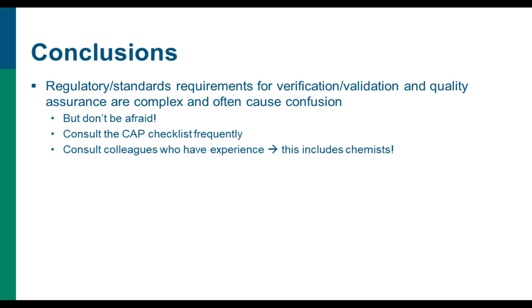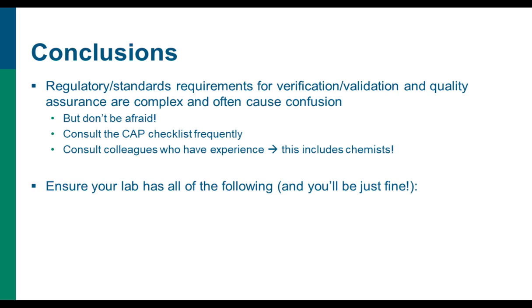But don't be afraid. Consult your CAP checklist frequently. They are very well defined there, and with time, CAP has gotten more specific with their requirements and more defined, so it's easier to understand. And don't be afraid to consult colleagues who have experience and ask them if you have questions. I put an important point here that this includes chemists. We don't often think of consulting with chemists in the microbiology lab, but they validate and verify quantitative tests all the time. Essentially, most of their tests are quantitative, so they are a great resource. If you have a chemist in your lab, you can ask questions there.